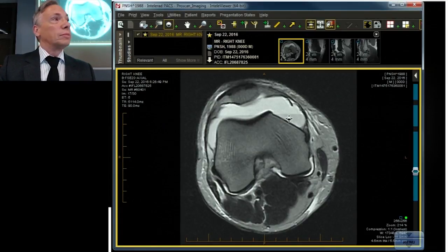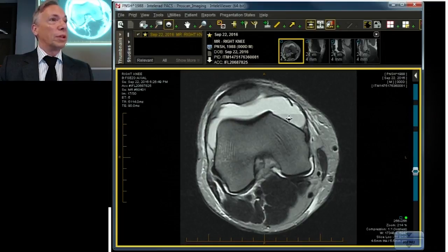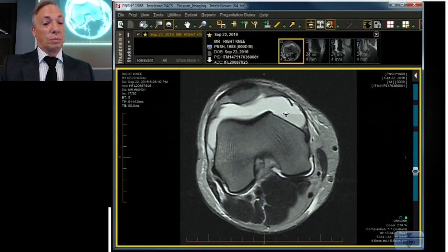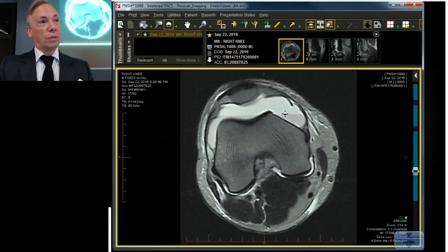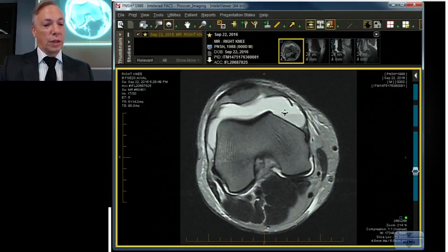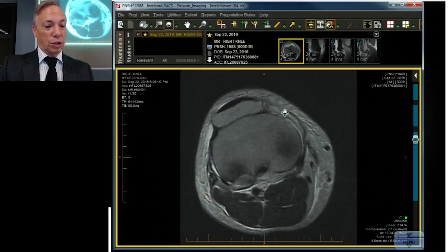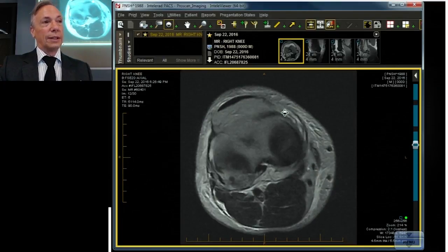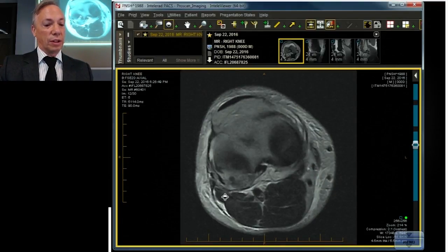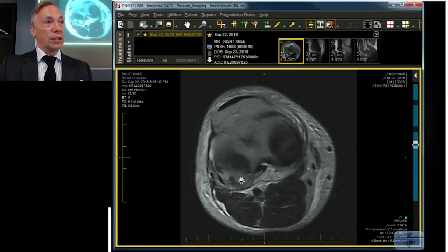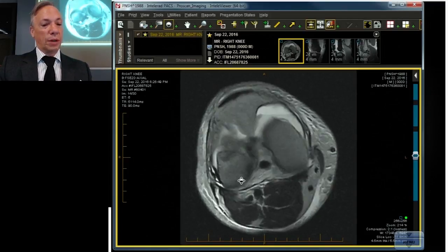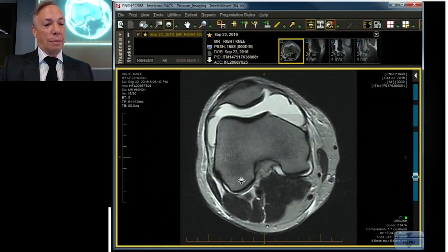First point: meniscal tears don't give you blood fluid levels. So there has to be something else wrong. Although that's not why we're showing the case. But as we scroll it, we see the reason for the blood fluid level — there's a fracture back here, which means something pretty violent happened.